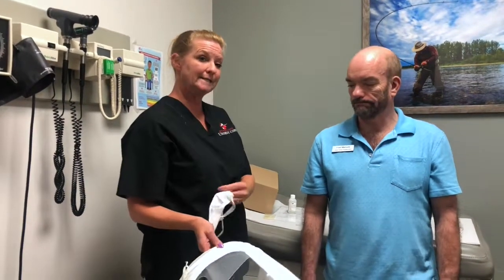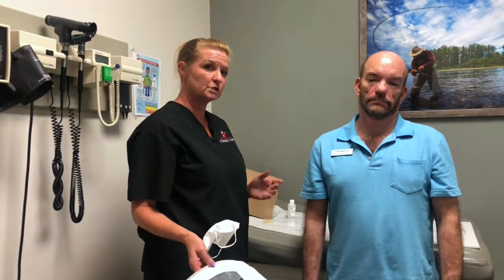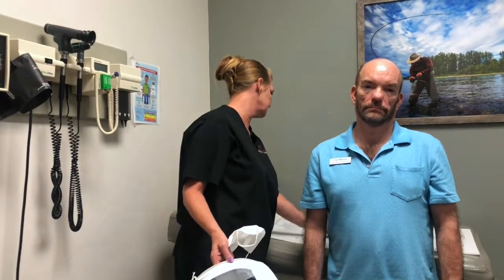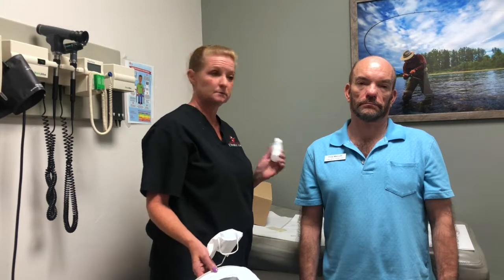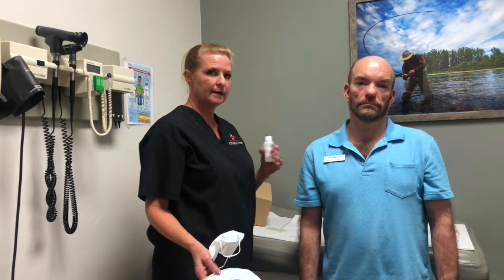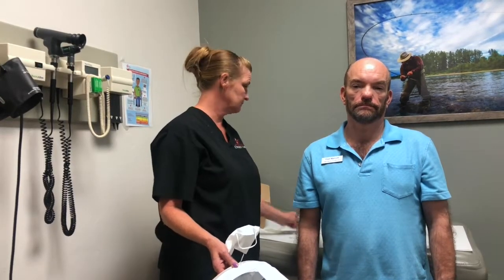After it was unclogged we did 10 sprays. If your patient cannot taste it at first, you're going to do another 10 sprays. You need to keep track of how many times — up to three or four sets — because that's how many times you're going to do the fit test solution spray. So if you had to do three different spray sets of 10 during the sensitivity test, then you're going to do the same number with the fit test.